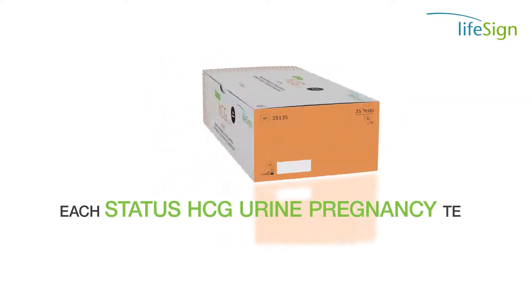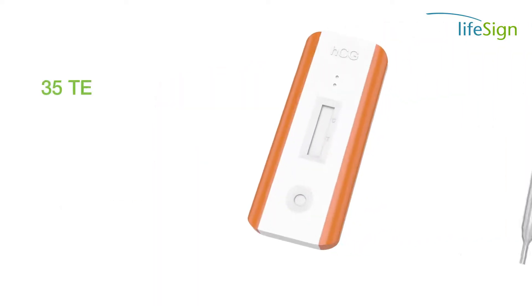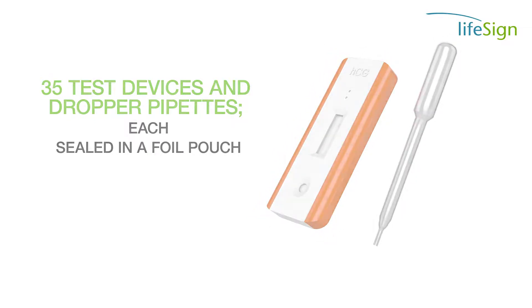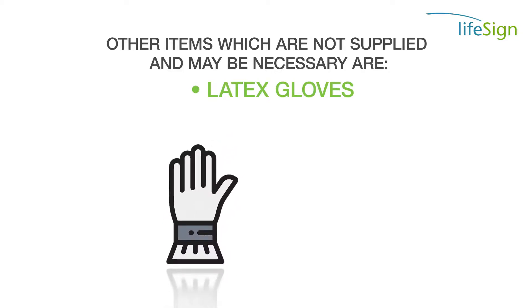Each STATUS HCG Urine Pregnancy Test Kit comes with the following items: 35 test devices and dropper pipettes, each sealed in a foil pouch, and one package insert. Other items which are not supplied but may be necessary are latex gloves and a timer.